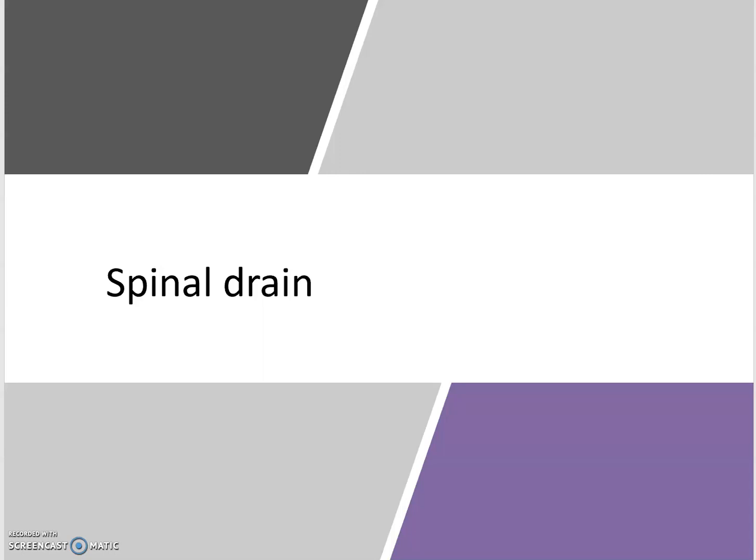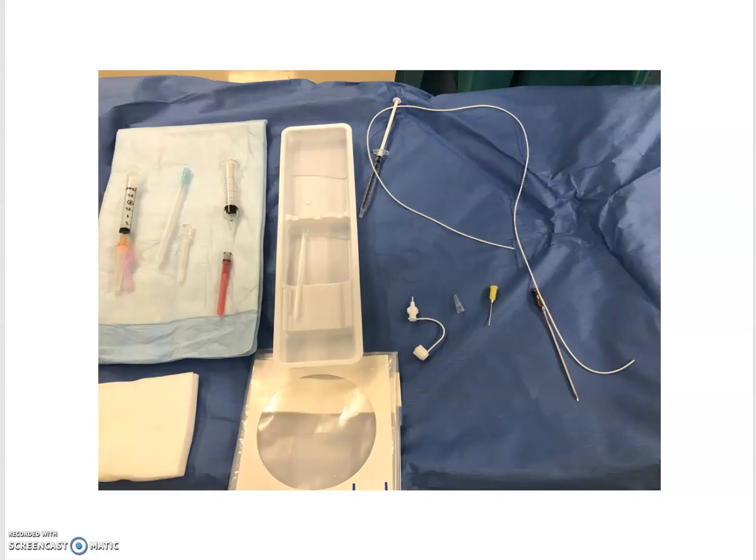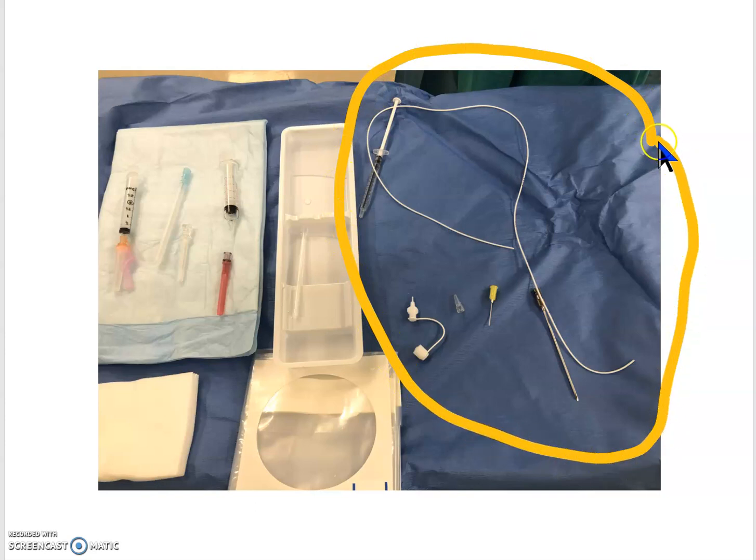The pack will look something like this — it will say 'lumbar catheter closed tip.' You're going to open that on a sterile field. The contents of your spinal drain pack will include your spinal catheter, the needle, a metal injection piece, your white port piece, and this little pyramid-shaped connector, which you will see is incredibly important.